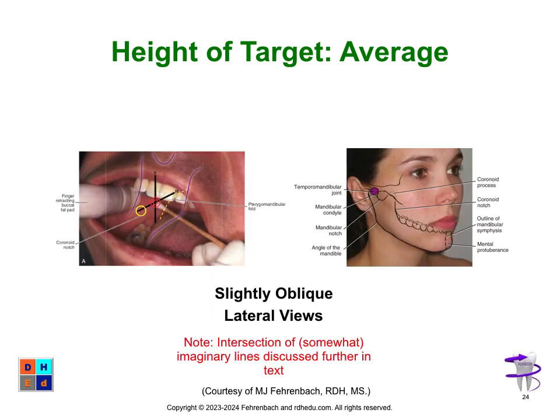Well, one thing I'm going to do is that it's an intersection. These are slightly oblique lateral views. Again, look at that over on one side, then put it together with the real world on the right side. Look at the angle of the mandible. Look at your mandibular notch. Then go over and see that condyle. Then your coronoid process, your coronoid notch, that's what we're going to go up and down to feel that. Okay, so we're on the ball.